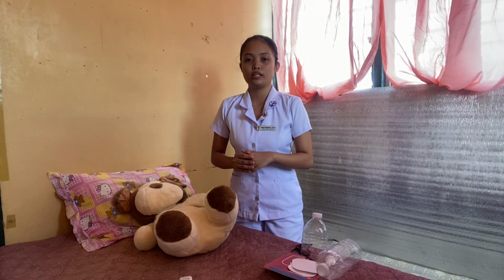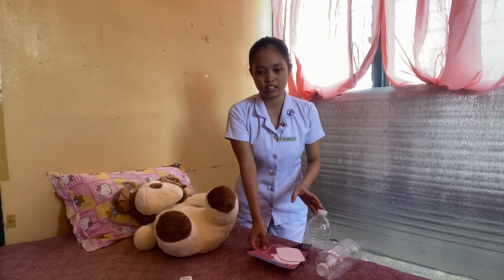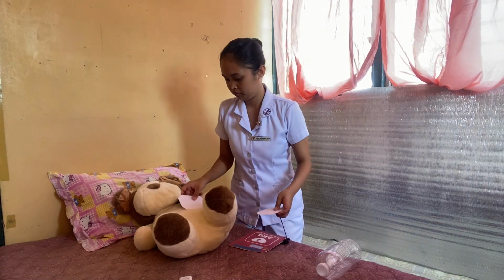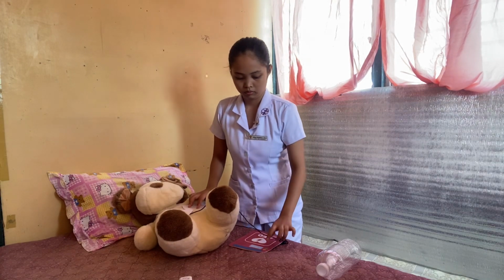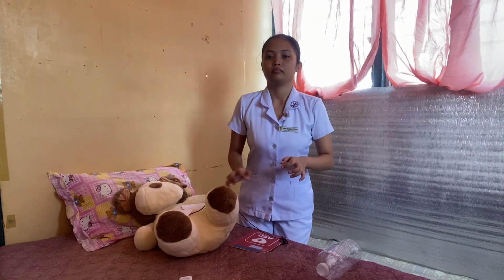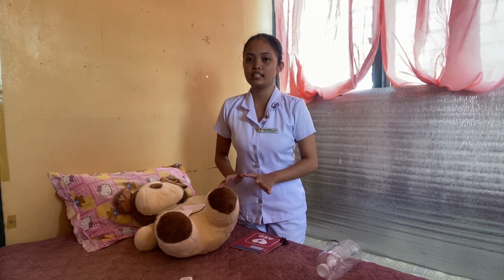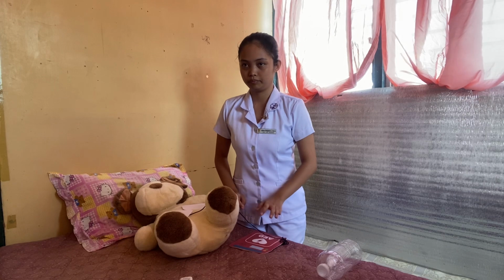Next is power on the AED and correctly attach the pads. Next is clear for analysis and clear to safely deliver a shock.